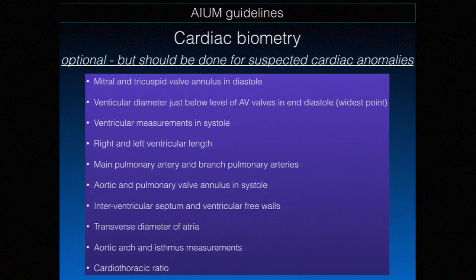And then in terms of the biometry measurements, according to the guidelines, they don't have to be done unless you suspect an anomaly. But I do think it is important to do them routinely so that when you do have an abnormality, you're making sure you're taking accurate measurements.